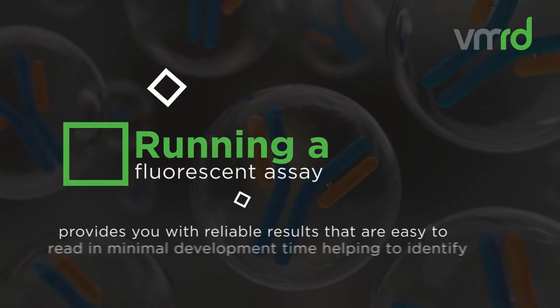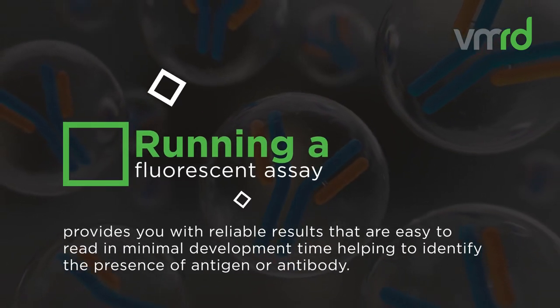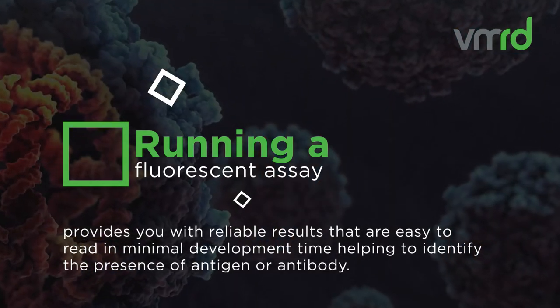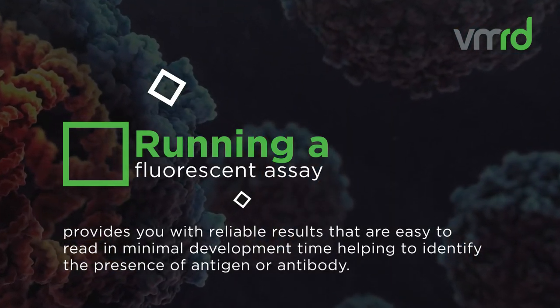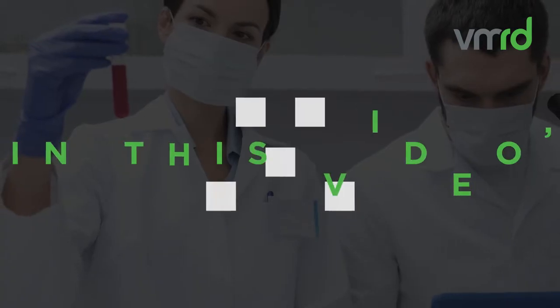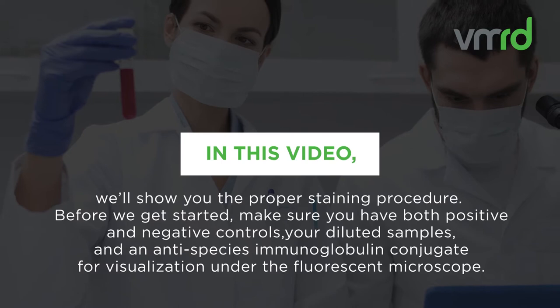Running a fluorescent assay with VMRD products provides you with reliable results that are easy to read in minimal development time, helping to identify the presence of antigen and antibody. In this video, we'll show you the proper staining procedure.